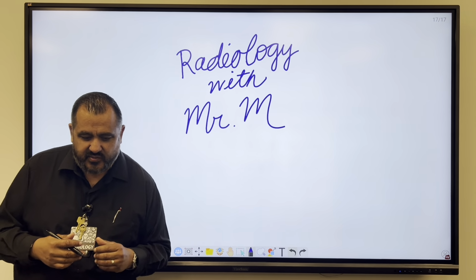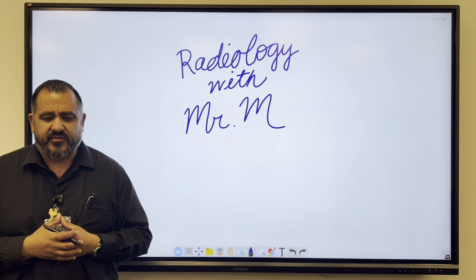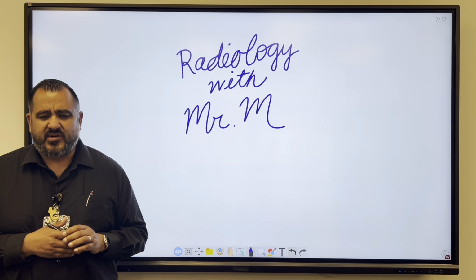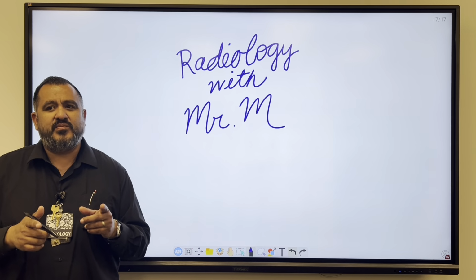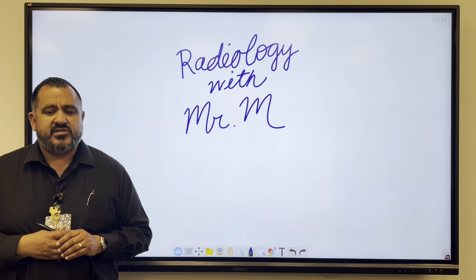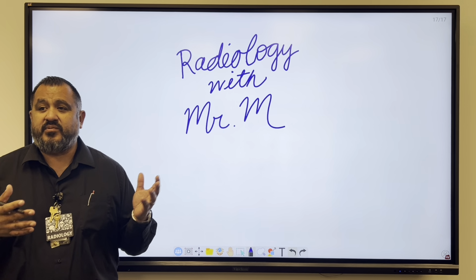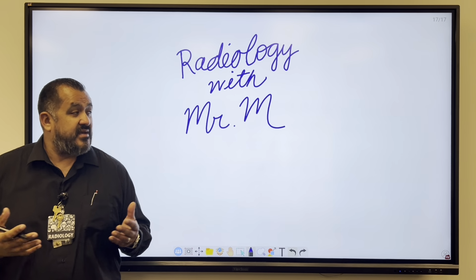But today we're going to be doing digital processing. And again, you guys, this is kind of just a quick rundown through the system. I try not to go into too much detail. Again, I want you guys to read the book, but I'm going over all the basics, all the key terms. So if you'd like to give me a question or a comment, please do so, and I'll try to respond as soon as I can.